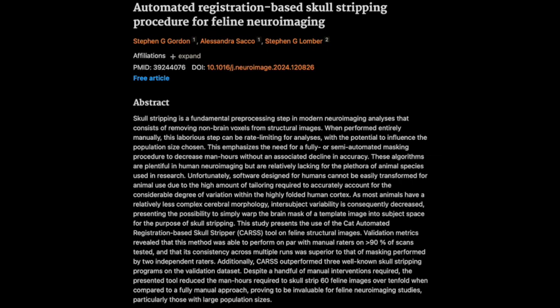To analyze brain scans effectively, we need to isolate the brain from all the surrounding tissues, and the skull is a big one. Imagine trying to examine a delicate flower encased in amber. The amber might be protecting it, but it also obscures the finer details. Skull stripping is like digitally removing that amber, allowing us to get a clear, unobstructed view of the brain itself. That makes perfect sense. So it's all about getting the clearest possible picture of the brain for analysis.